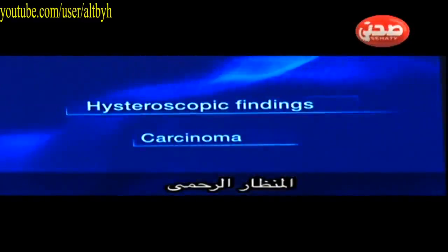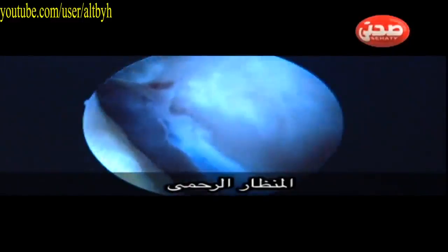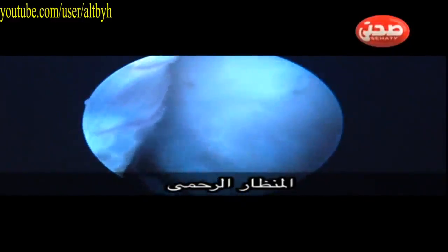Carcinoma is one of the very important pathologies which we always suspect in postmenopausal patients, especially if the endometrial thickness is more than 5 millimeters. And in this case, hysteroscopy was done for a lady with postmenopausal bleeding, and a malignancy was suspected. As you can see, the endometrium looks abnormal with high suspicion of malignancy, with neovascularization and abnormal looking endometrium. As you can see here, this is the abnormal vasculature.